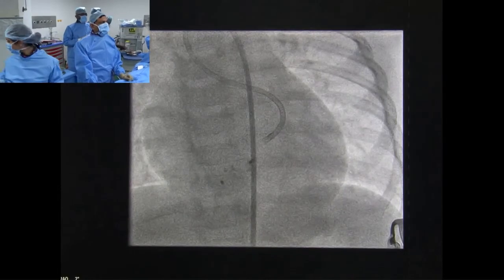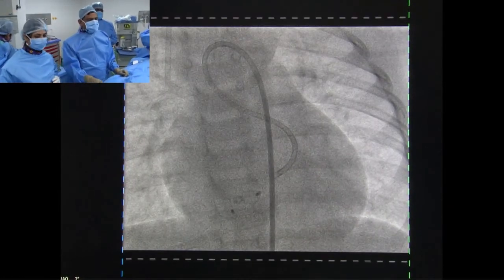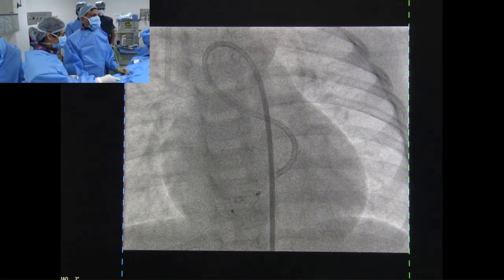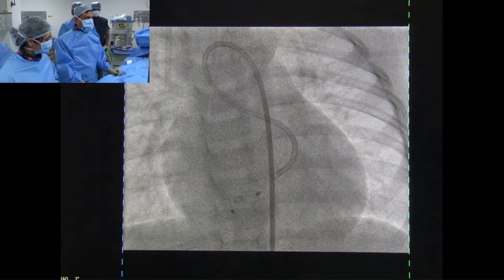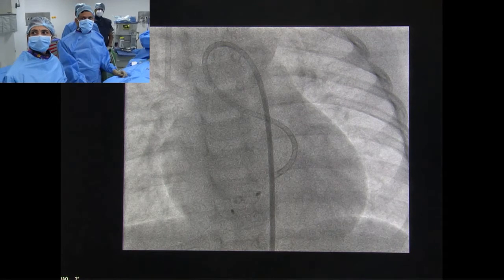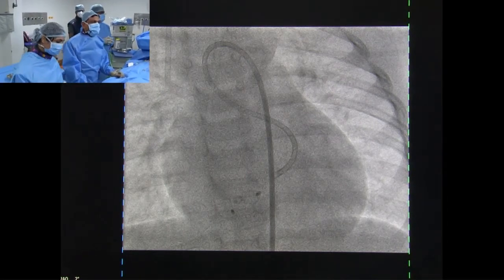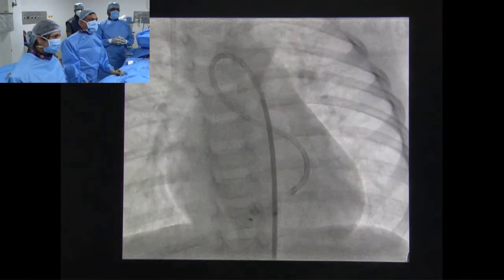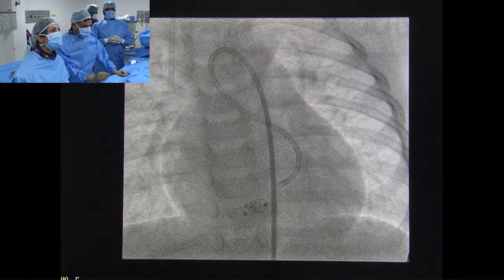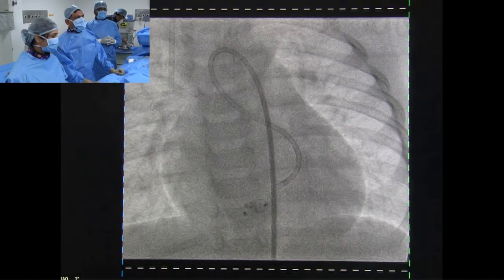I think for the coronary fistula, I have found the AVP4 is the best suited because it doesn't have retention discs. Yeah. So it just plugs very nicely. No, and, otherwise, this is a reasonable result. I mean, I don't think it's a bad result at all. It's just one very small distal vessel, which probably shouldn't matter. All the points raised by Bharat are very valid. You have a fairly dilated coronary, which could thrombose, and you need to watch this very carefully.